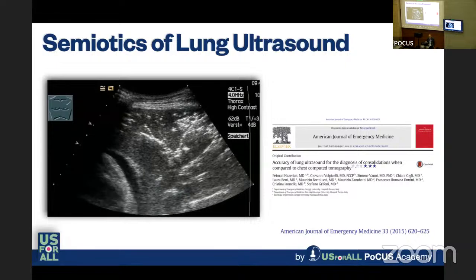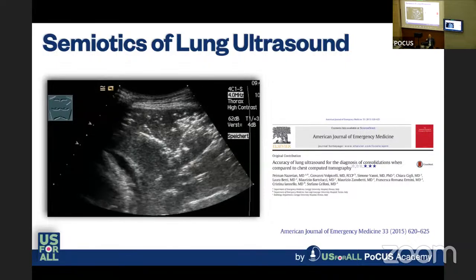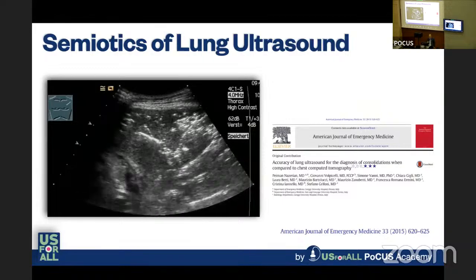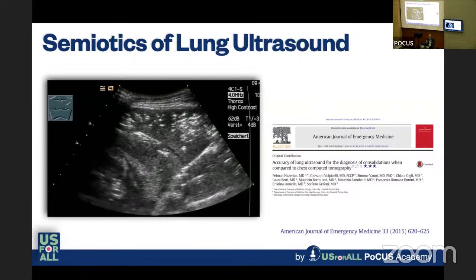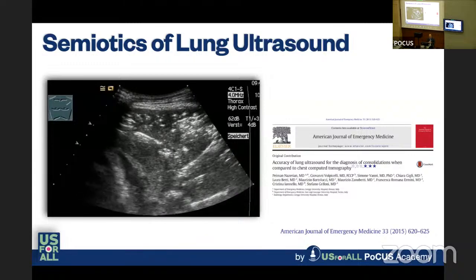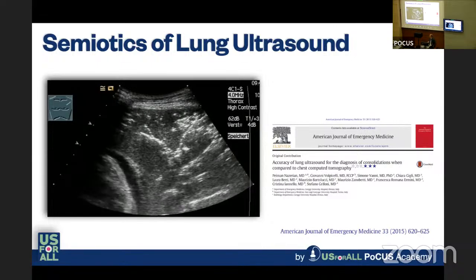We see finally a real anatomic image of the consolidated lung. That happens when in the lung there is no more air. So because the lung is totally deflated or for some reason totally closed to the entrance of air, we have a consolidation, and this is very well visible by ultrasound.